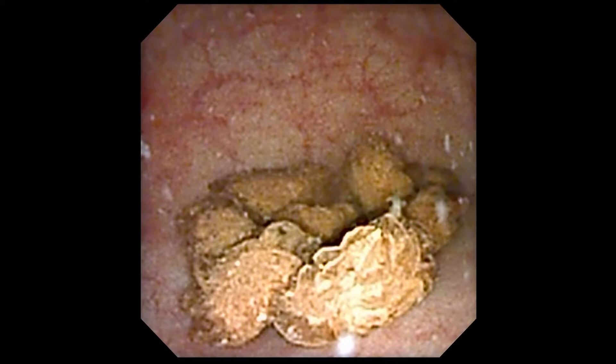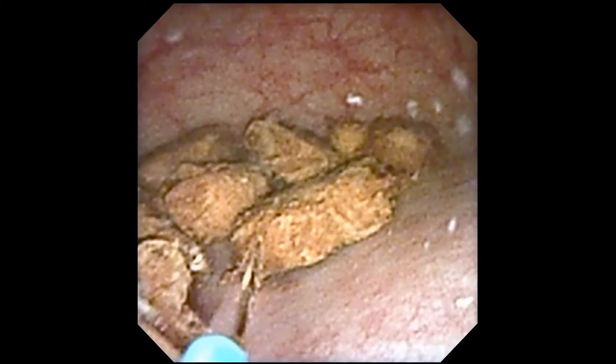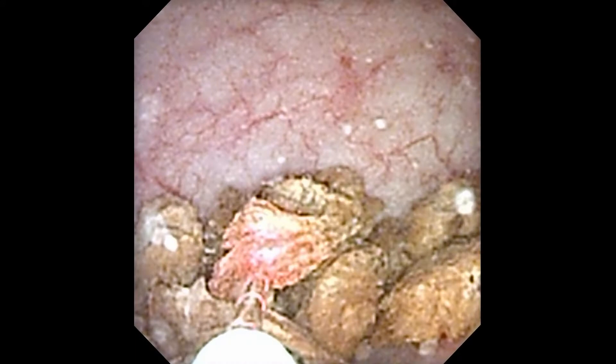I had to develop a strategy, and quickly, and this is what I came up with. Number one: on the first pass of the scope, I'm going to break up all the stones into very small fragments. So if I can't get the scope back in, I'll at least be able to void all the fragments out.